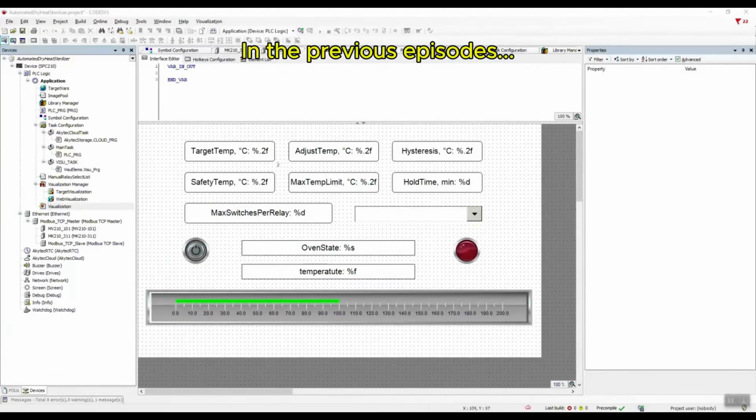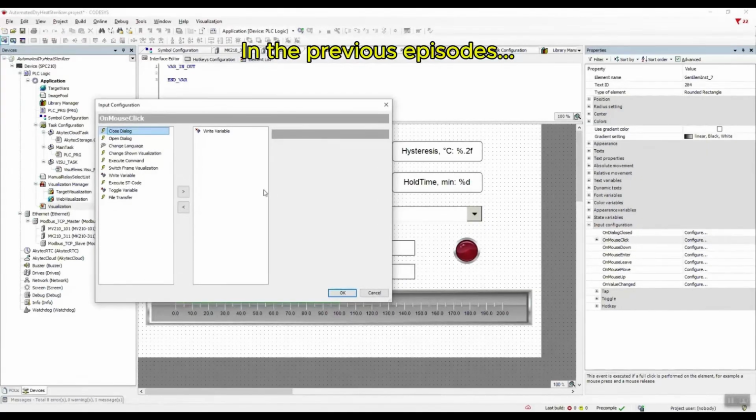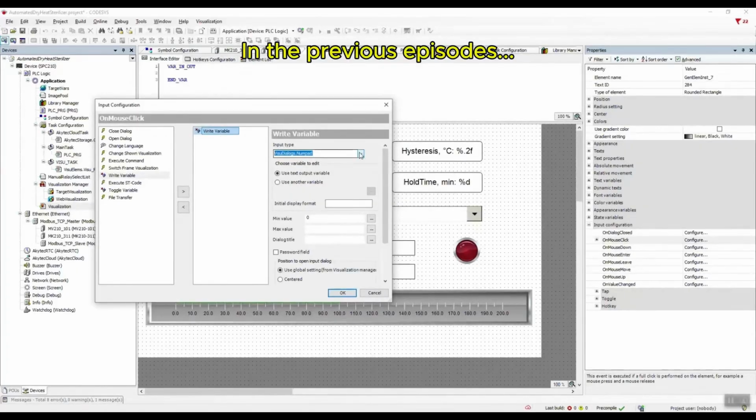The first component is a rectangle. To enter new values, let's set up a click event handler and select the function to handle this event, writing to a variable. In the input type field, select the Visu dialog's numpad dialog, or simply put, the digital keypad window. Set the minimum value field to 0, so the user can't enter a negative value.